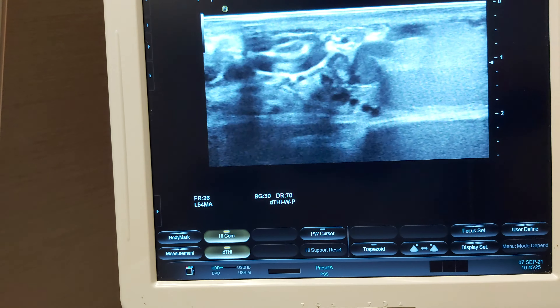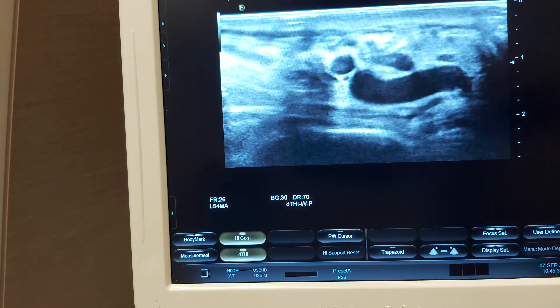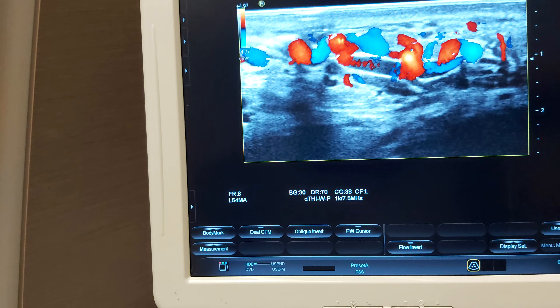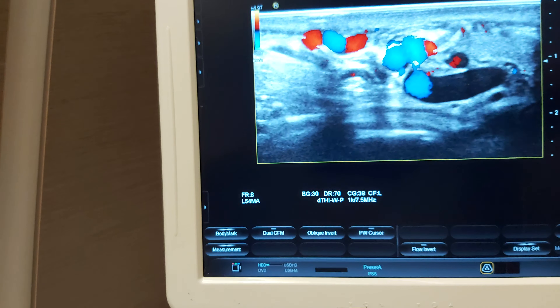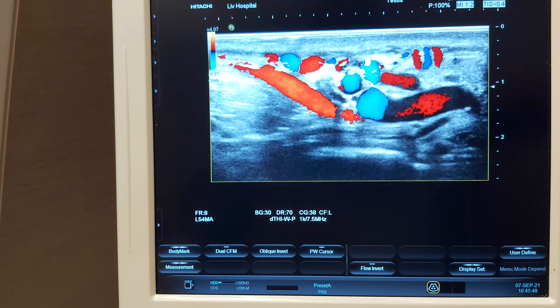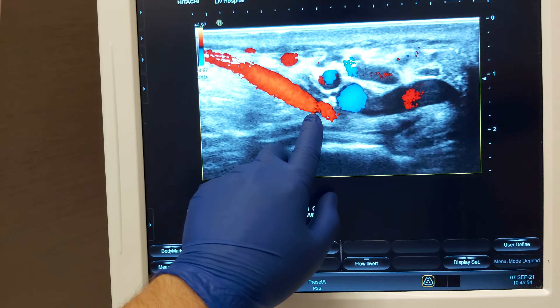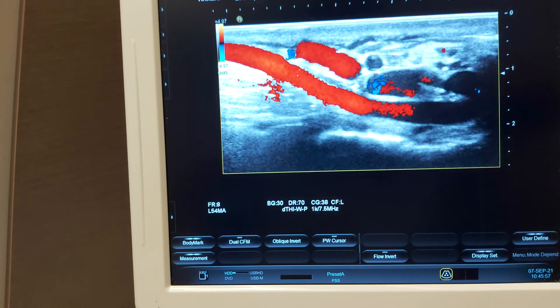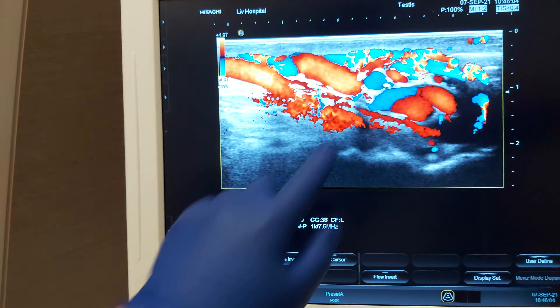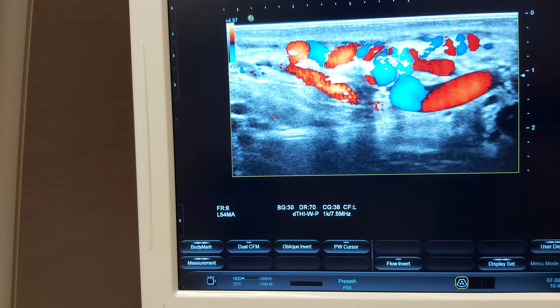This is the main difference of our procedure, because we noticed that veins don't disappear by themselves when you just ligate them and leave them behind. Now I will look if there is any reflux — I start with Doppler. You are not straining now, just normally breathing. Do you have pain sometimes? Yeah. Because in your normal standing position you already have reflux — the color is coming into the veins. That means you always have reflux. Can you strain a little, push yourself? When you push, look — there is more reflux.